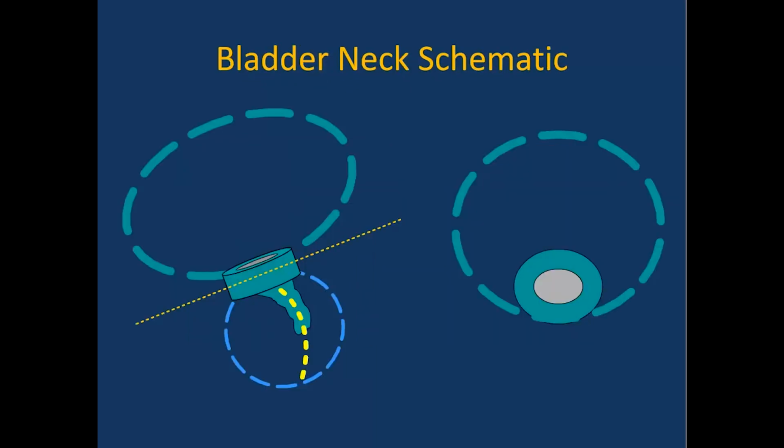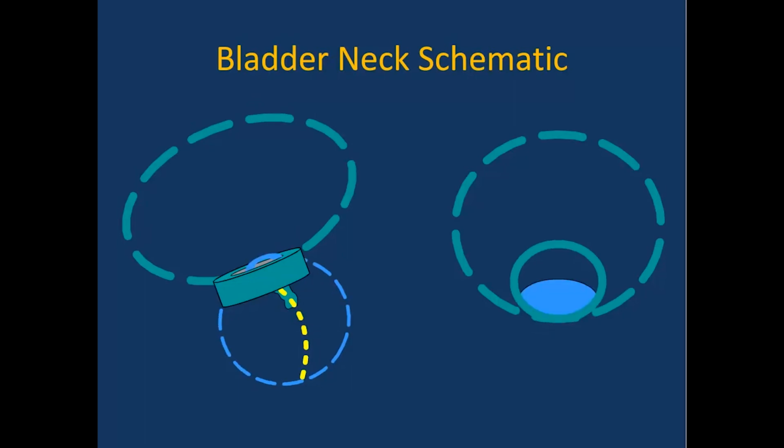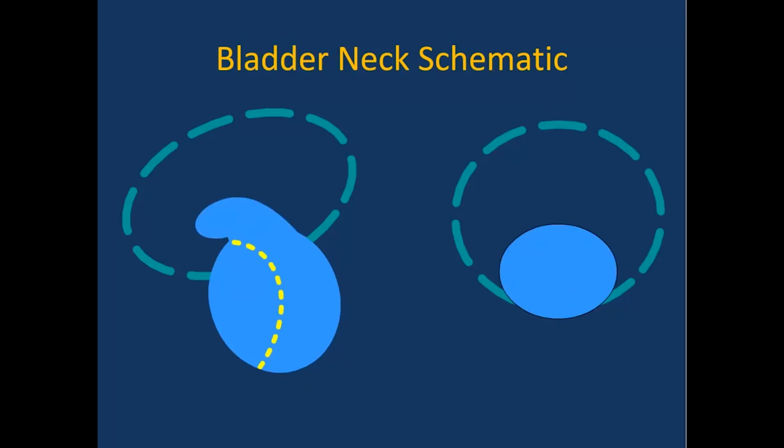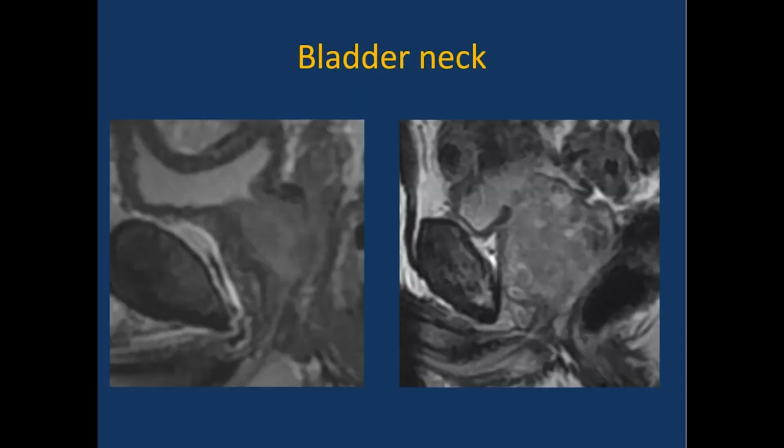Bladder neck, I just want to go through how spectacular the bladder neck anatomy is depicted. And as you age, the transition zone hypertrophies and sort of pushes up and obliterates the bladder neck. So if we look at what we would call a level 1, you have a completely intact bladder neck. Level 2, you sort of have effacement, kind of crowding. And then level 3, it's actually going into the lumen of the bladder. Finally, you get this median lobe, where it's asymmetric, where one part comes up and overarches the other. Again, you can see this so clearly.